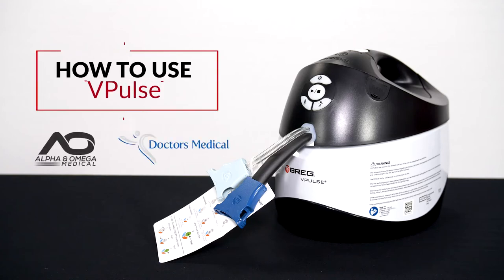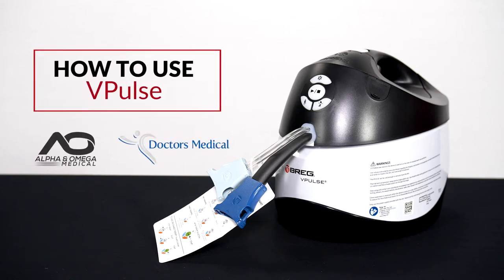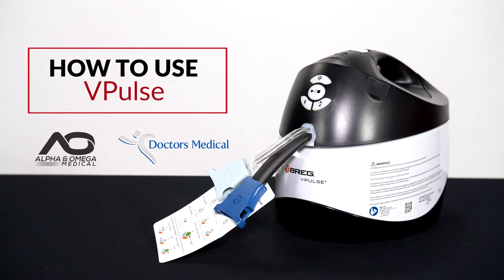In this video we're going to review how to use your vPulse cold compression DVT prevention machine.